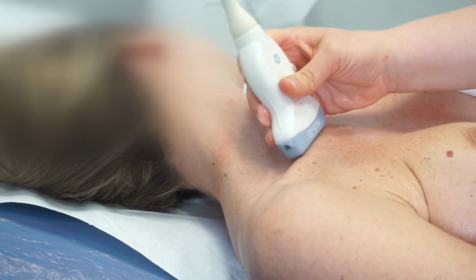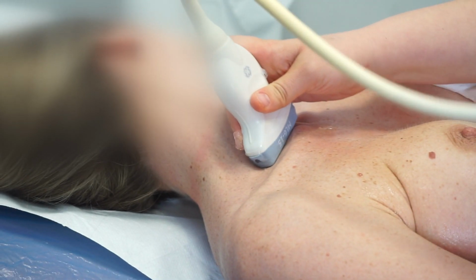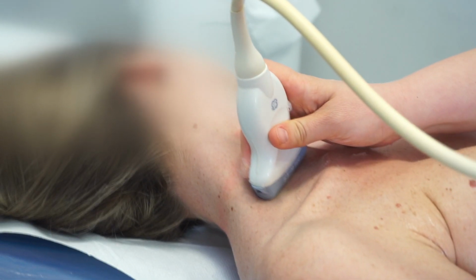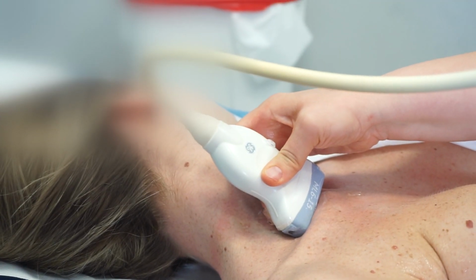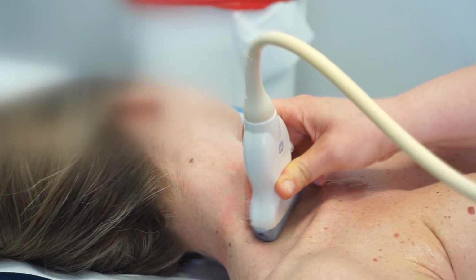The probe is first placed in the transverse plane on the superior border of the clavicle and swept from caudal to cranial along the sternocleidomastoid muscle. The same movement is repeated on the trapezius muscle.